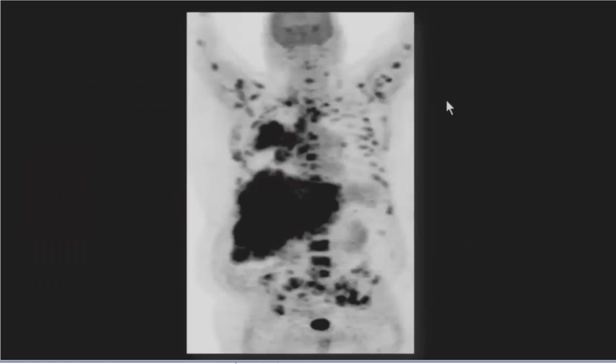And we can contrast that with this patient here, who, as you can see on this PET-CT, really had mets throughout their entire body. And so clearly there is a difference in the overall prognosis based on the location and the number of metastases. So this is a potential source of something that could be addressed in future staging systems.